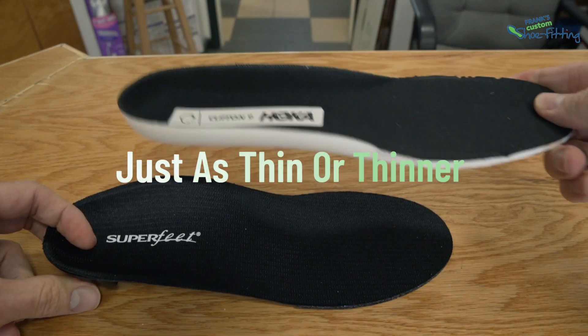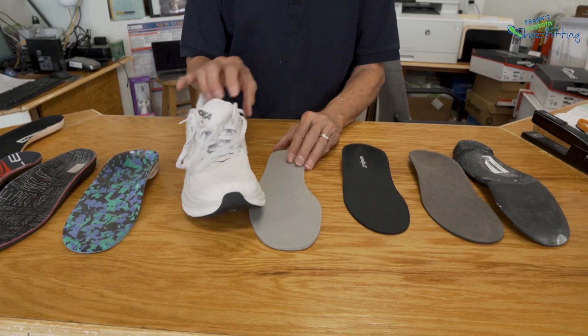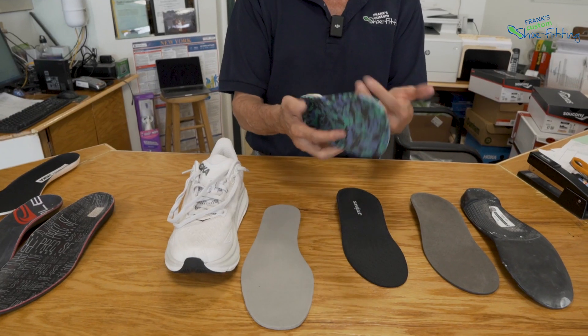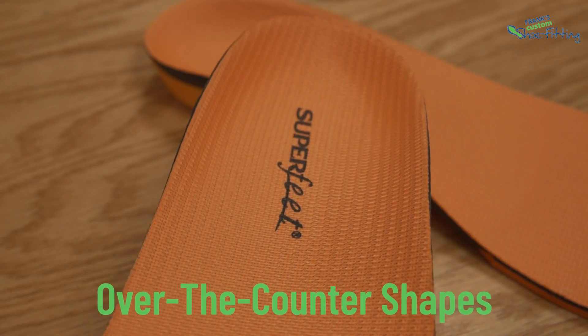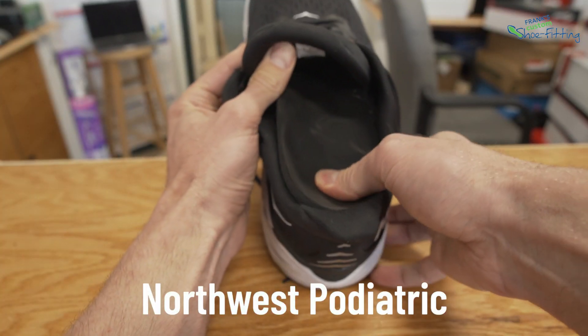So whatever you buy, you want that thing to be just as thin or thinner, so it takes up very little room in the shoe and doesn't make the shoe too tight. This is why over the years we've stayed away from bulky orthotic types that take up too much room, crack, break, and don't capture foot shape. We're not big fans of many systems out there, but we are big fans of the ones we use and make here in the store, whether they're over-the-counter shapes or shapes we fabricate through our lab called Northwest Podiatrics.